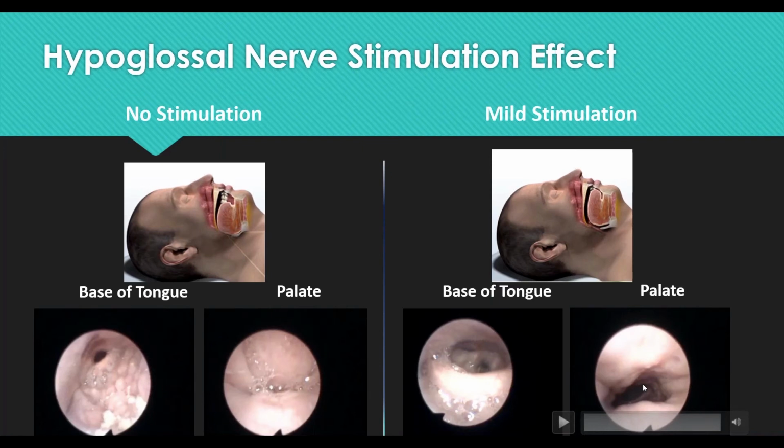A lot of patients are able to go home and not use any narcotic pain medications. They're able to get away with Motrin and Tylenol and do quite well. And from a device-related side effect profile, it's well tolerated. Like we just said, it doesn't seem to cause discomfort or issues with either nerve discomfort or numbness, tingling, or pain in use. And it does not cause residual speech or swallowing issues after the patient wakes up in the morning and turns it off.